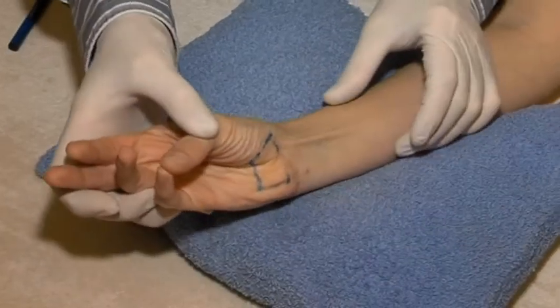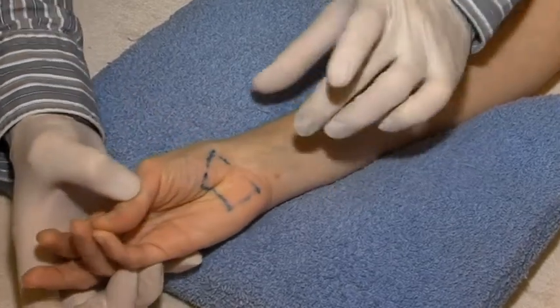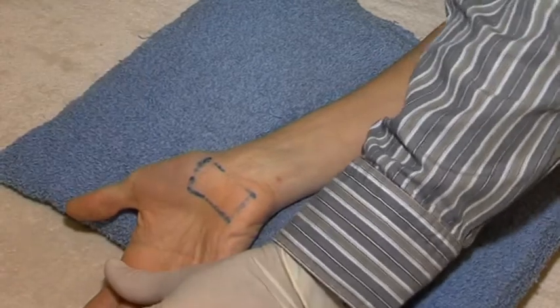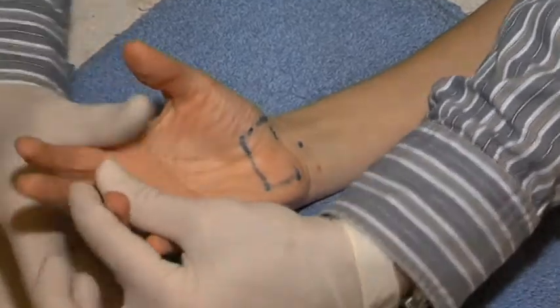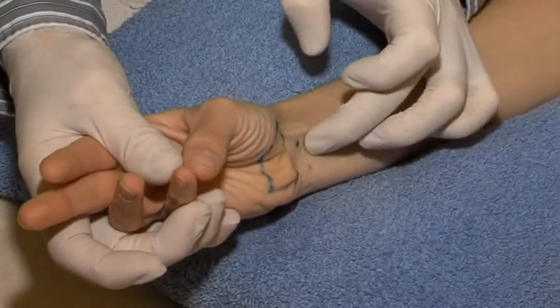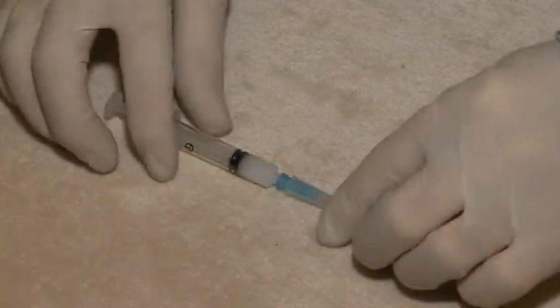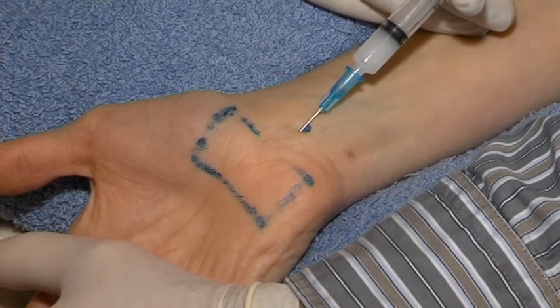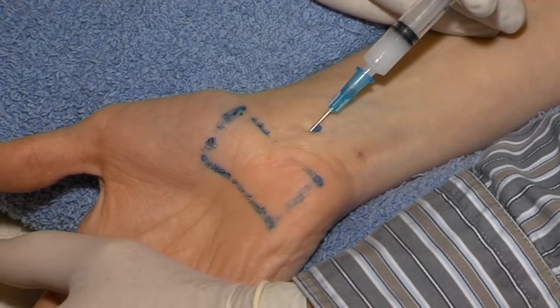We locate the palmaris longus tendon. The needle is inserted almost horizontally, 2 cm proximal to the upper border of the carpal tunnel, and medially to the palmaris longus tendon.